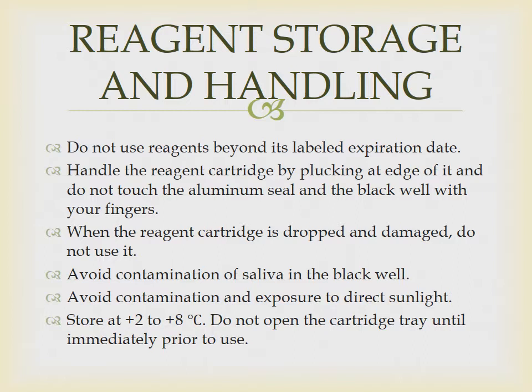Avoid contamination of saliva in the black well. Avoid contamination and exposure to direct sunlight. Store at +2 to +8 degrees Celsius. Do not open the cartridge tray until immediately prior to use.